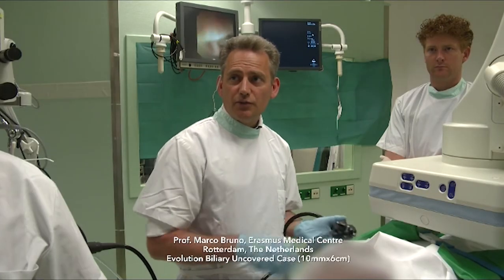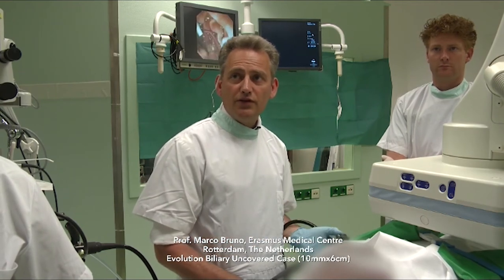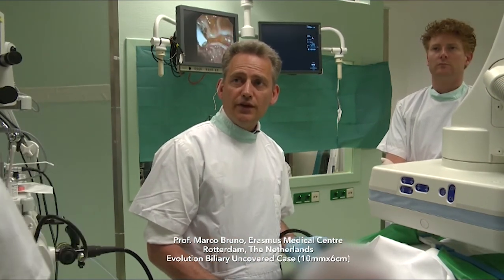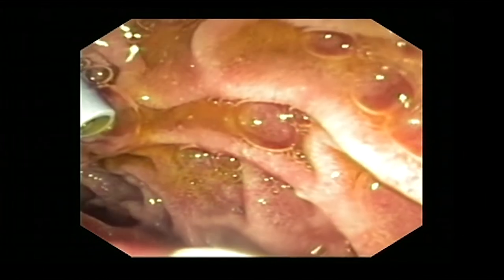We've just started this procedure in a male patient with obstructive jaundice who presented some time ago with a suspicion of a pancreatic malignancy. The patient was already treated and underwent an ERCP, during which a plastic stent was placed and a distal stricture was observed in the common bile duct. We have now entered the second portion of the duodenum, and as you can see there is a plastic stent.